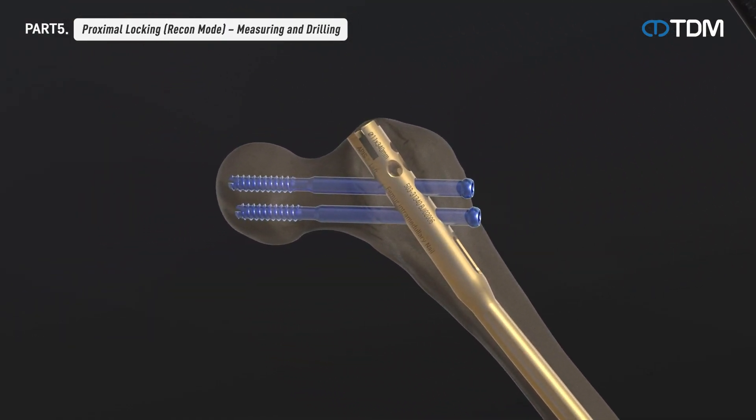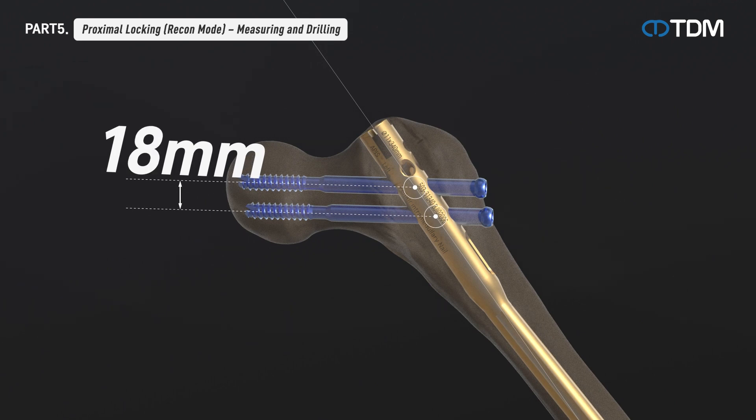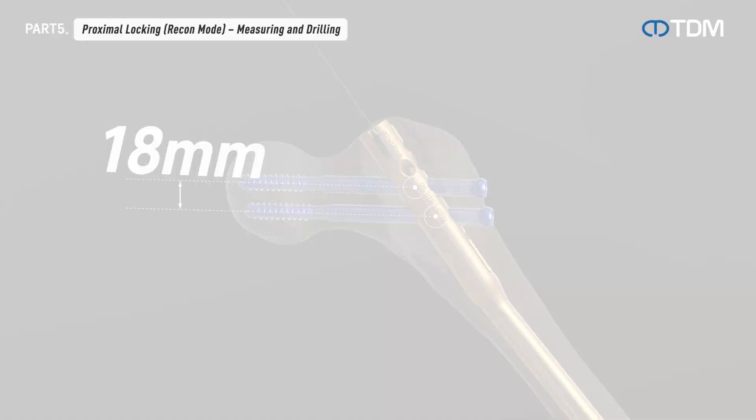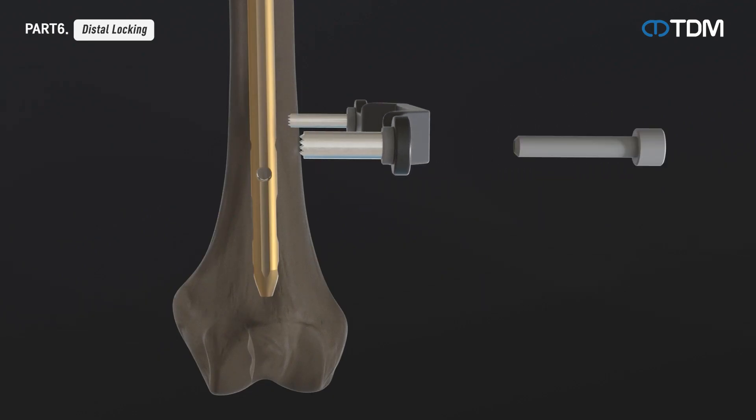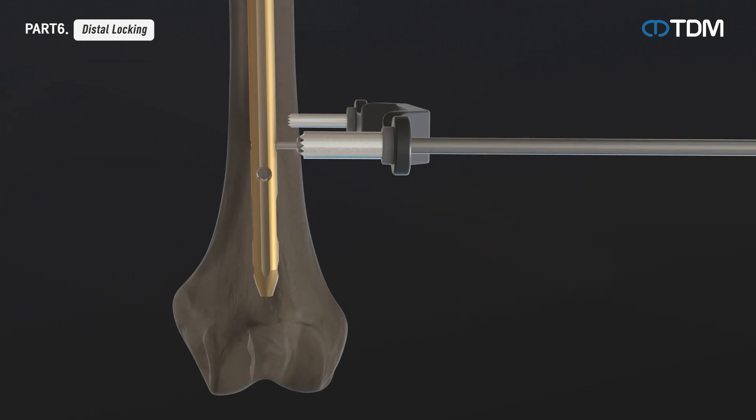The distance between the two 6.5 millimeter screws inserted into the proximal hole of the reconstruction locking nail is 18 millimeters, allowing stable treatment for fractures of thin bones in women and the elderly. Distal screw insertion should be done using the freehand technique: drill to the center of the screw hole using the freehand drill guide, check the depth with a depth gauge, and then insert the screw.